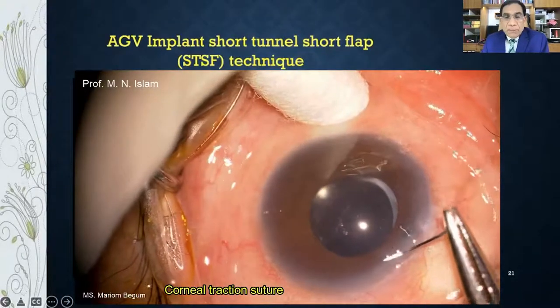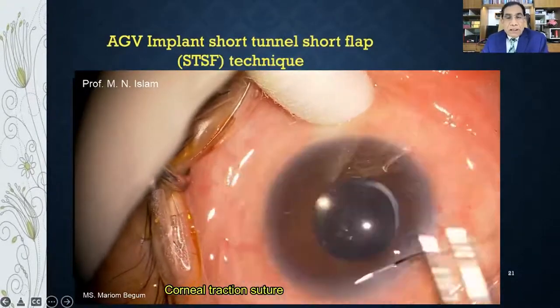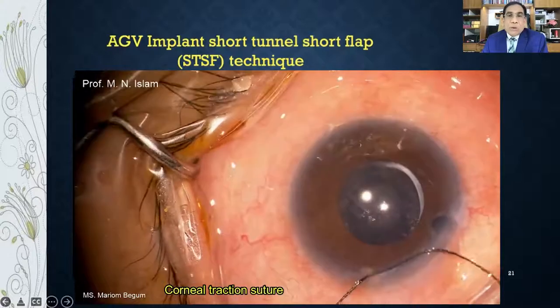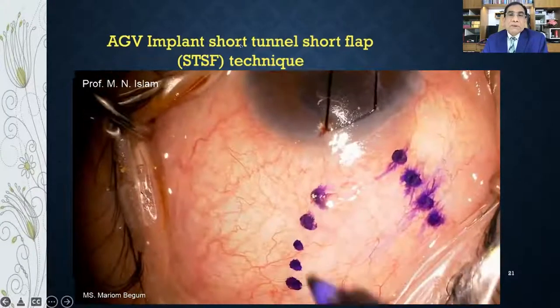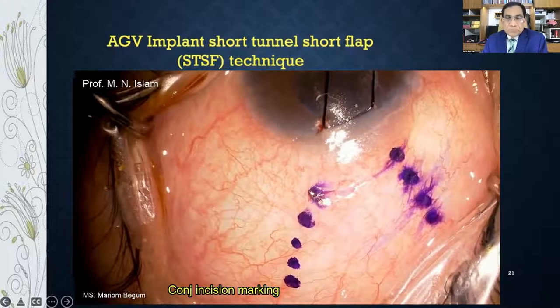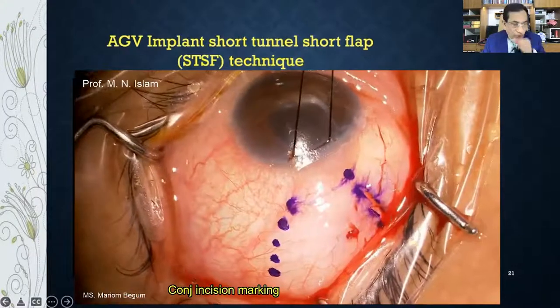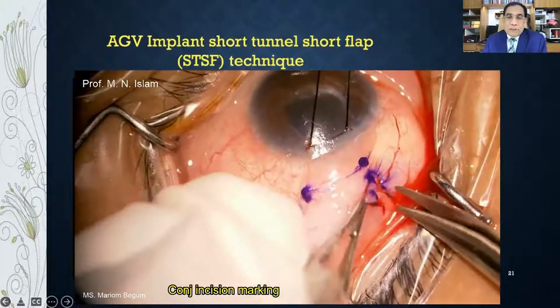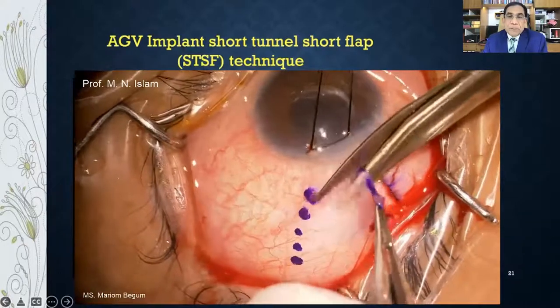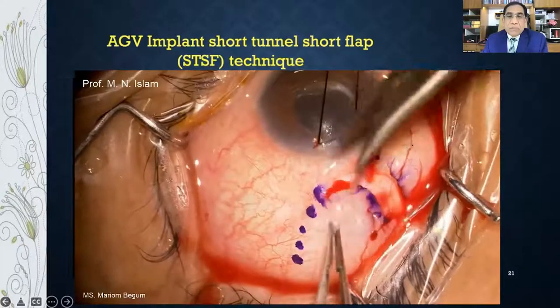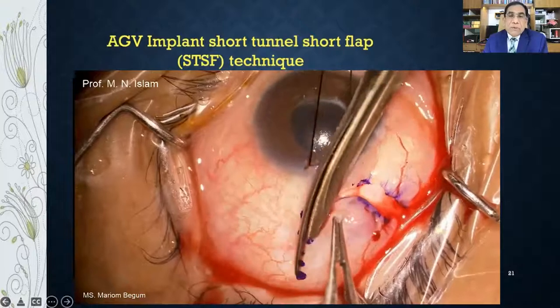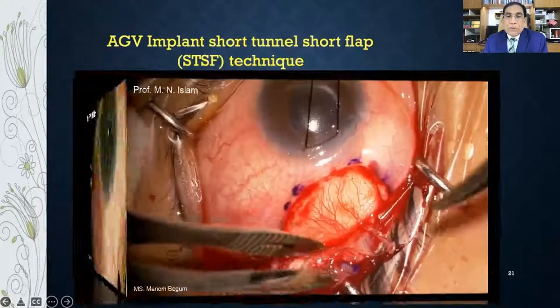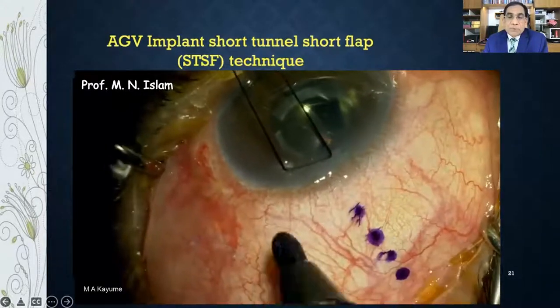Let me show a video clip of how I implant the Ahmed Glaucoma Valve using the Short Tunnel Short Flap (STSF) technique. I mark the conjunctival peritomy, doing a fornix-based peritomy. If you do not mark it, you can inadvertently cut in the wrong place. I am going from 12 o'clock toward the lateral rectus muscle for a right eye.